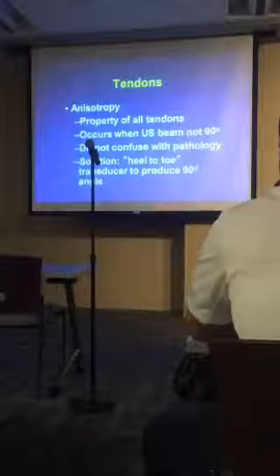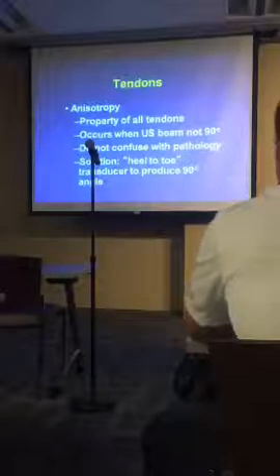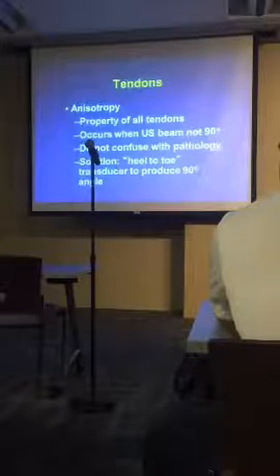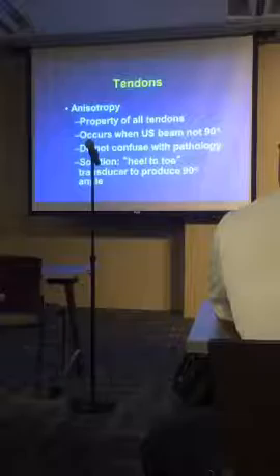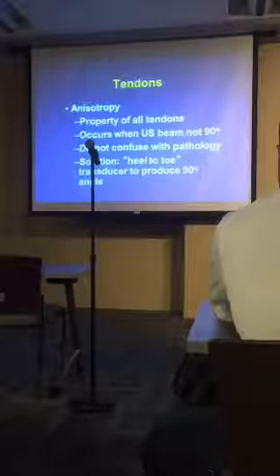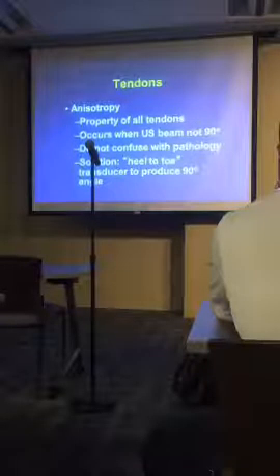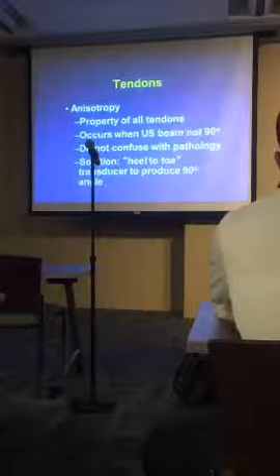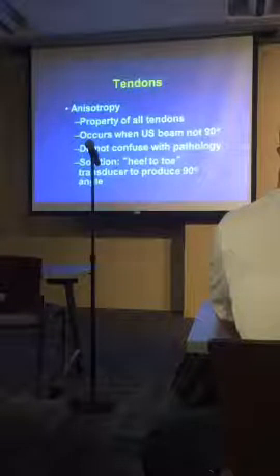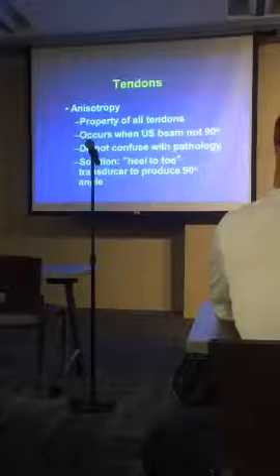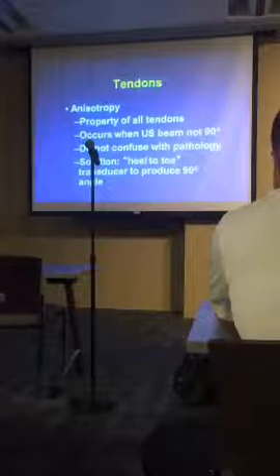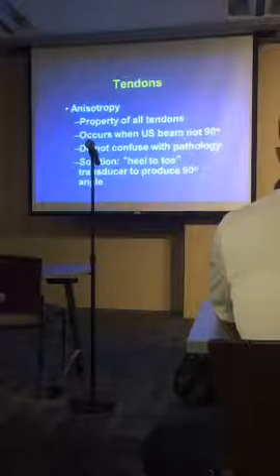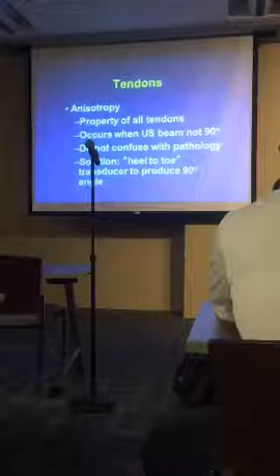There is a property of all tendons we need to be aware of: anisotropy. It occurs when the ultrasound beam is not at 90 degrees to the tendon. When the beam hits the tendon obliquely, it bounces off into another plane and you get no information back — the tendon looks black. The solution is to rock the probe in a heel-to-toe maneuver to produce a 90-degree angle. For example, imaging my own biceps tendon in the shoulder: if you just place the probe down, you don't see a fibrillar pattern because the beam is oblique to the tendon.